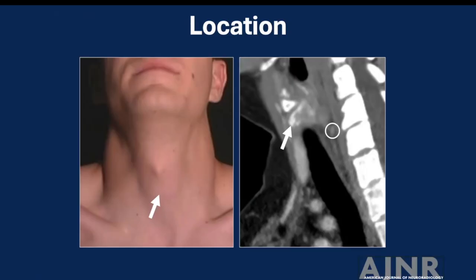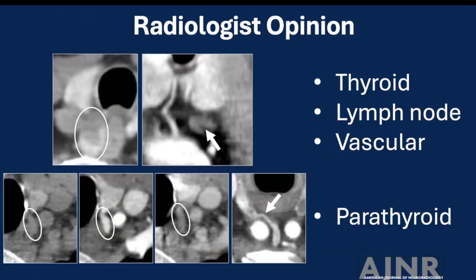in the reoperative neck. Refreshingly, the surgeons want to know what we think each candidate lesion represents. If presented with high and low confidence lesions in the same patient, they will often start with a minimally invasive approach to the high confidence lesion and plan to convert to bilateral neck exploration if the intraoperative parathyroid hormone levels do not drop as expected.